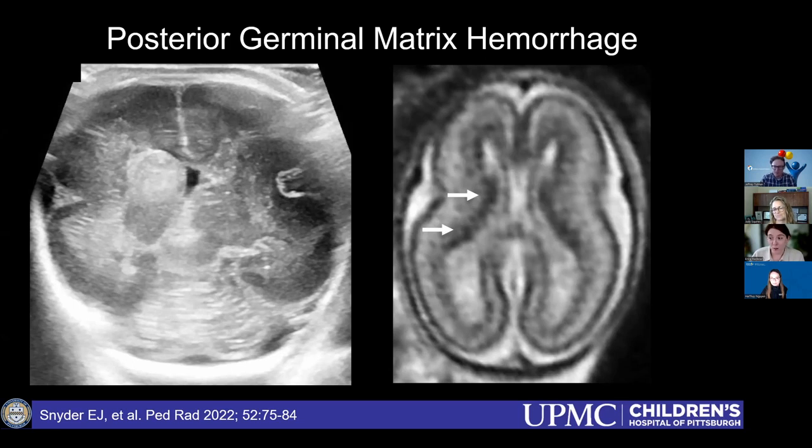I tend to be descriptive. I also tend to lean really heavily on the follow-up imaging, and we'll comment retrospectively if the follow-ups, like in this case, have changed really significantly. But I agree. I think we're just starting to see babies of this gestational age hitting our NICUs, and this is something that we need to be following as radiologists to see what the outcomes actually are.